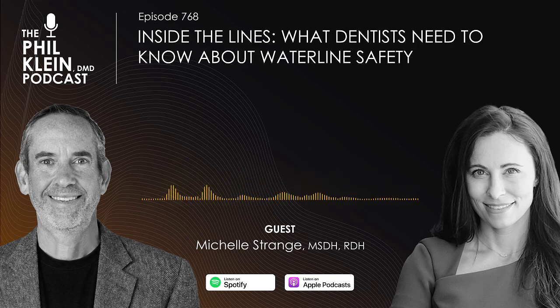So doing those three things, which you reference as being the trifecta, which is a great name for it, is the critical thing. If you do any one of the three and you don't use the other two, you're going to get failures where the CFU is going to exceed 500.